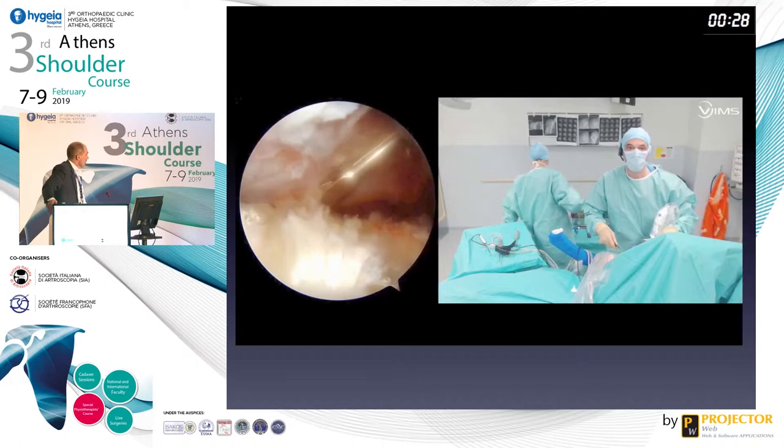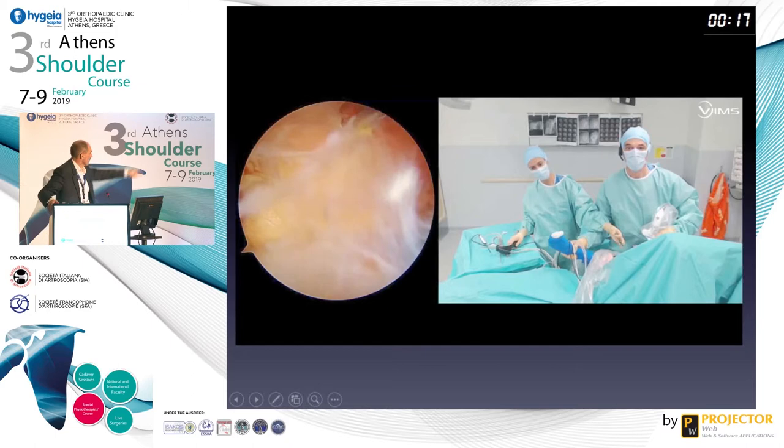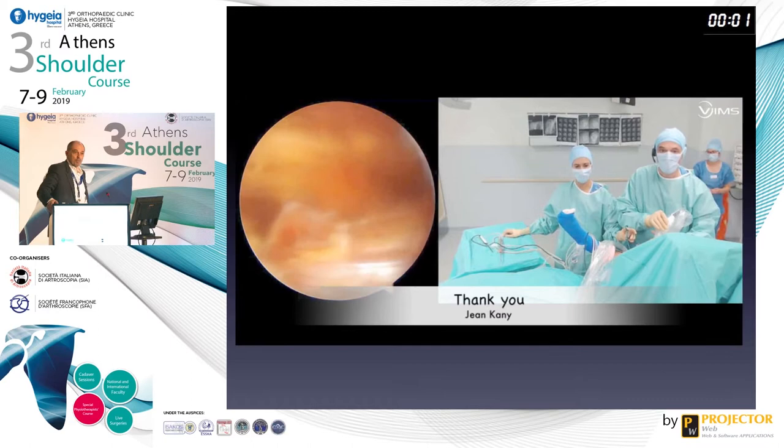And now you can see I lift up the conjoint tendon, and I want to see the impingement between my lat dorsi and the axillary nerve and vessel. You can see how close the two anatomic structures are. So this is the reason why you have to control and release all this area. This is also the reason why I think it's not possible to take both the lat dorsi plus the teres major. I think only the lat dorsi is enough.